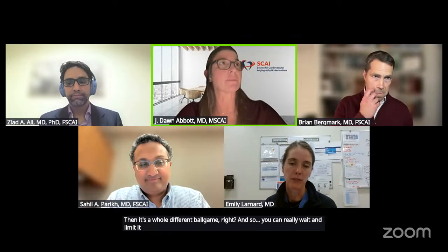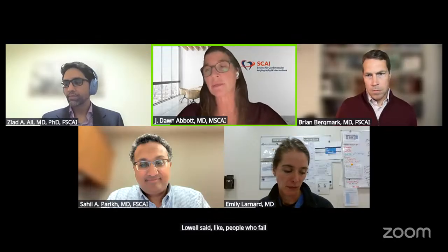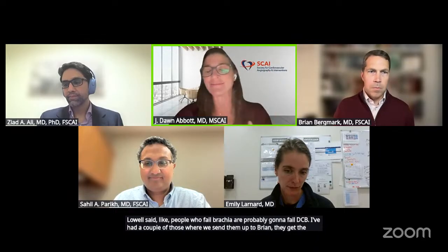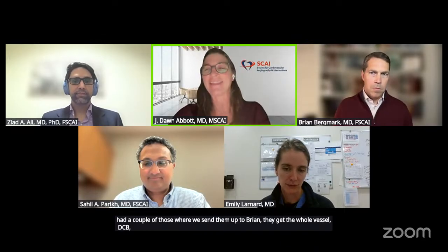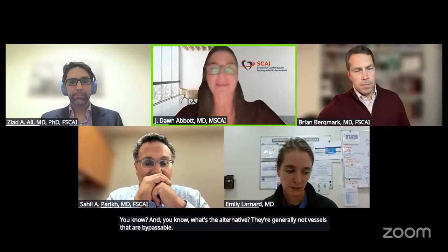I'm telling people now, I think Lowell said, people who fail brachy are probably going to fail DCB. I've had a couple of those where we send them up to Brian, they get the whole vessel DCB, that brachy, and then they have focal recurrent ISR. And we just sort of bring them back every 6 months and keep DCBing them, and what's the alternative? They're generally not vessels that are bypassable, not going to brachytherapy them again, not going to stent them again.